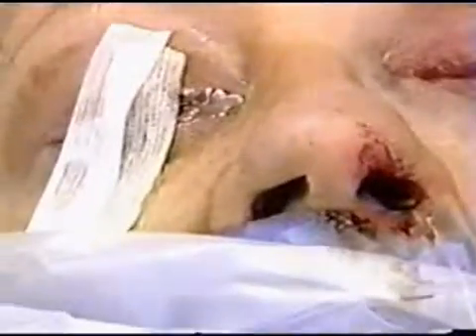Here both ends of the stent can be seen exiting the balloon DCR ostium on the right of the screen. The nasal septum again is on the left. The smaller diameter end of the stent is left much longer than the large diameter end and is cut off just inside the nares.